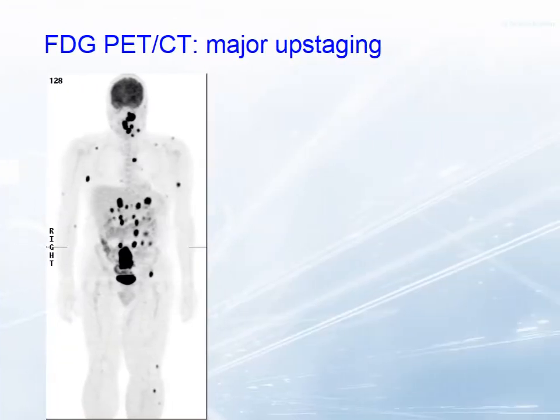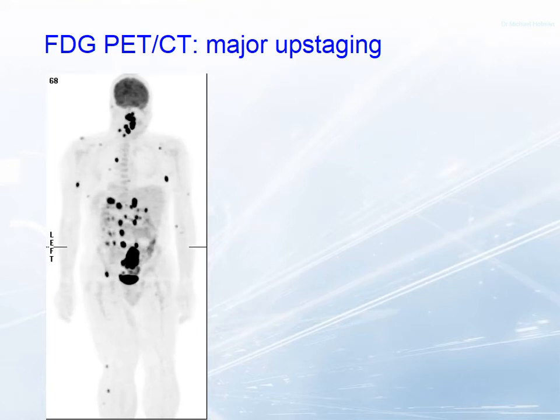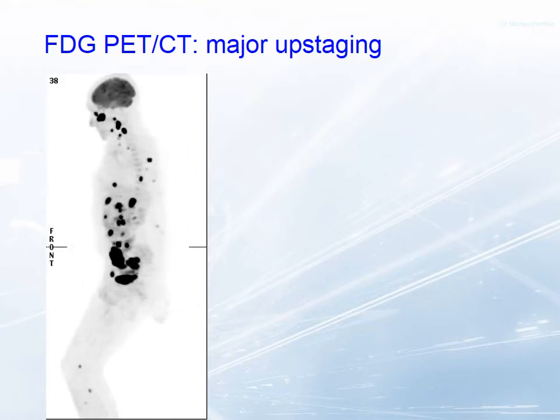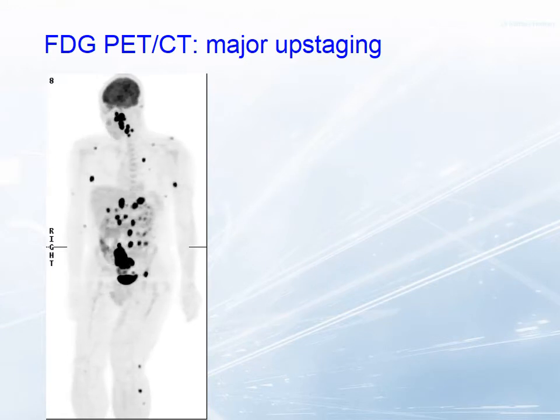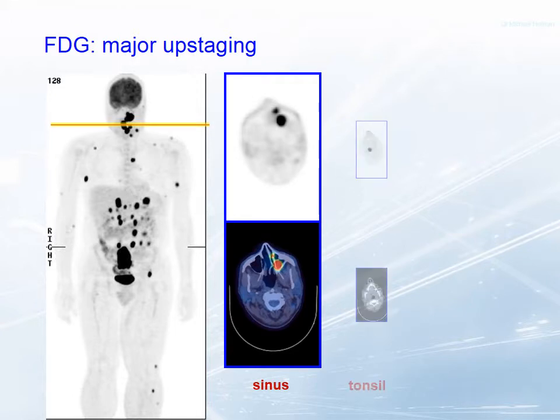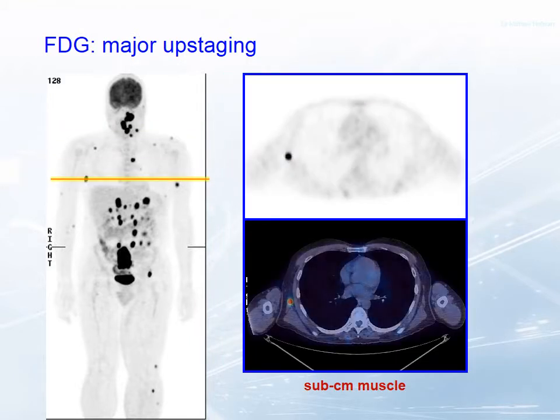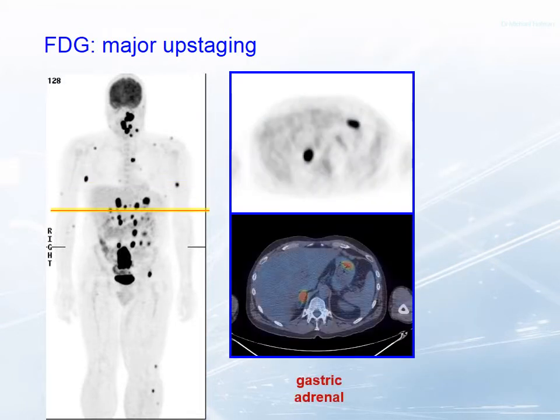Nowadays we perform an FDG PET scan. We inject radioactive sugar, and tumors — particularly the more aggressive ones — use sugar as their metabolite for growth, and they light up very brightly. It's difficult to believe this patient only has a single abnormality on conventional CT. We can see metastases lighting up in odd places: the sinus, the palatine tonsil. We can visualize with quite high confidence sub-centimeter muscle metastases, a gastric metastasis — which was the cause of the patient's symptoms — and the adrenal metastasis, which was thought to be solitary.